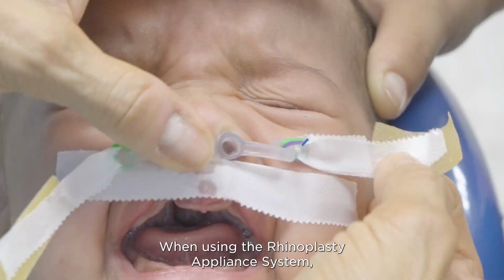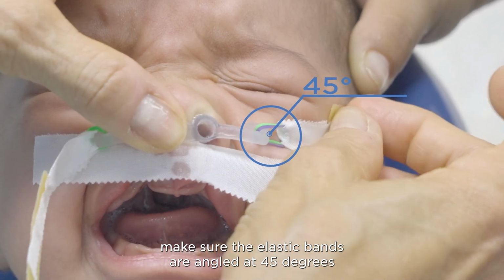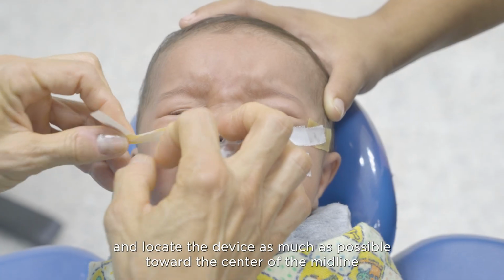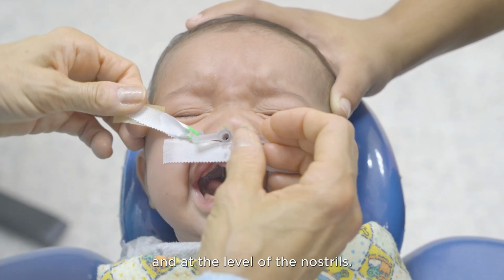When using the Rhinoplasty Appliance System, make sure the elastic bands are angled at 45 degrees and locate the device as much as possible toward the center of the midline and at the level of the nostrils.